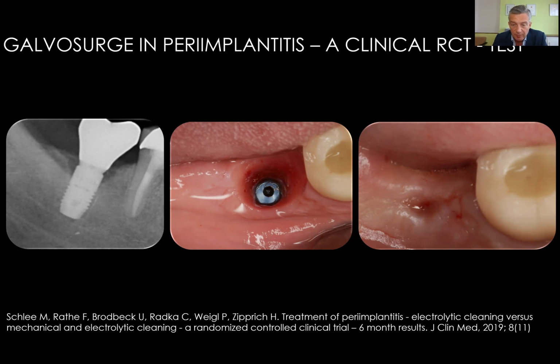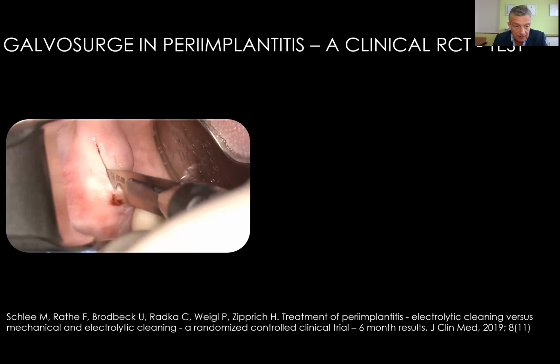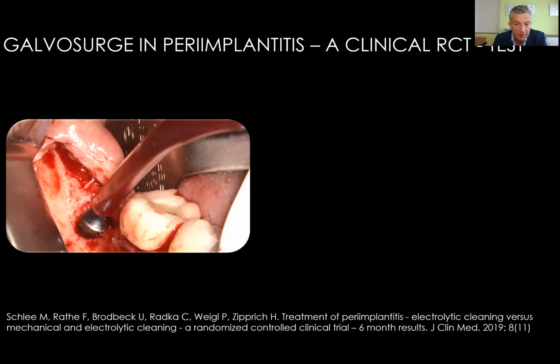We removed the restorative parts, and after 2 weeks, the flap almost closed. There was a little fistula which remained. We opened a classical flap with a crestal incision, and this was the site we found.